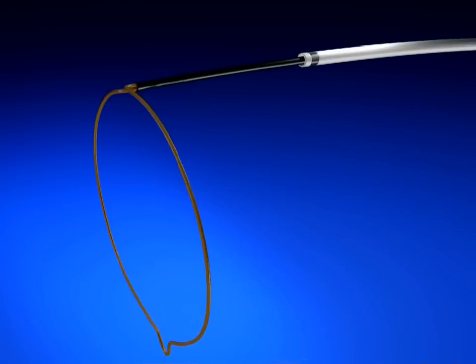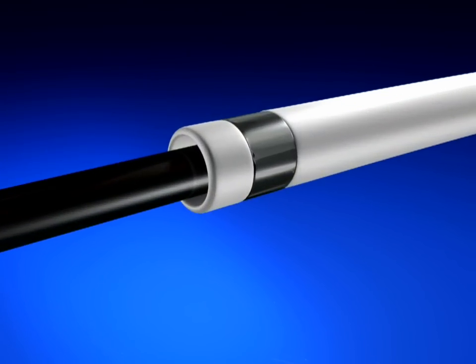To support accurate snare deployment within the desired vessel site, a platinum iridium radiopaque marker band is incorporated at the distal end of the One Snare catheter to promote visibility under fluoroscopy.